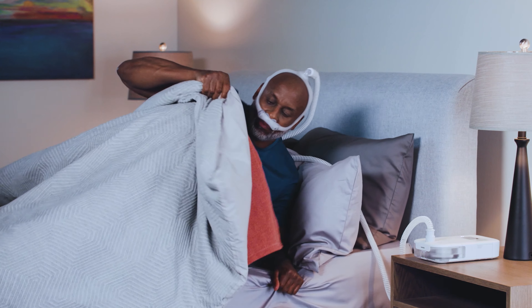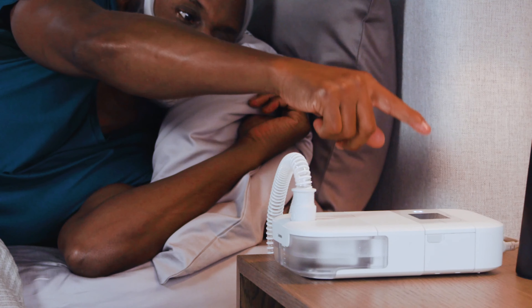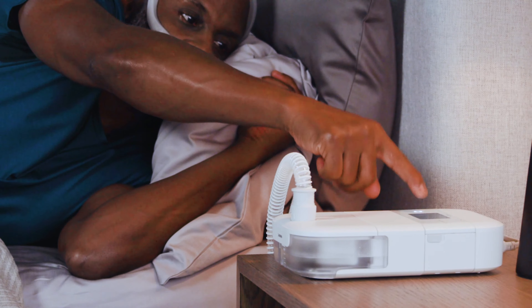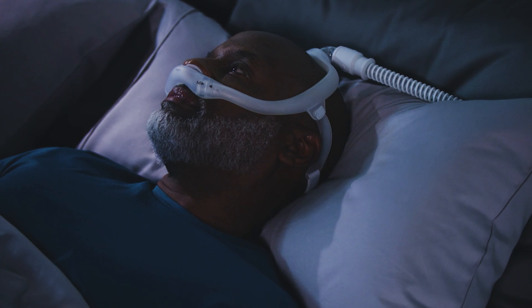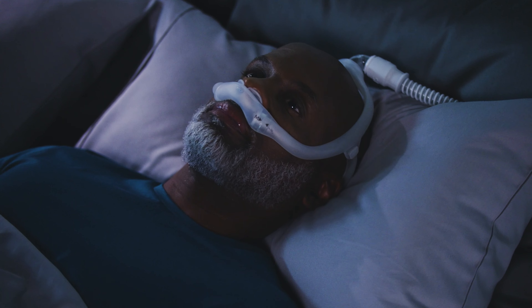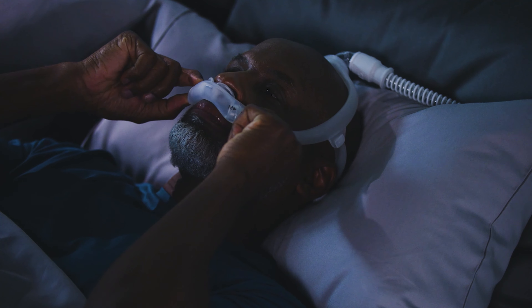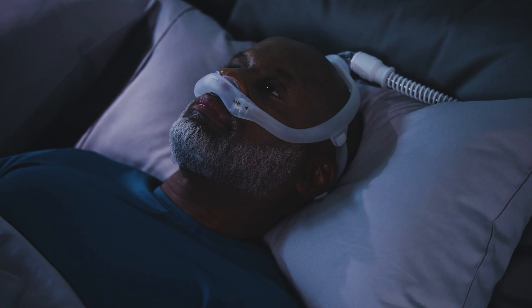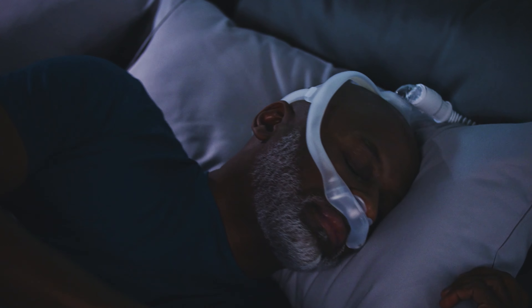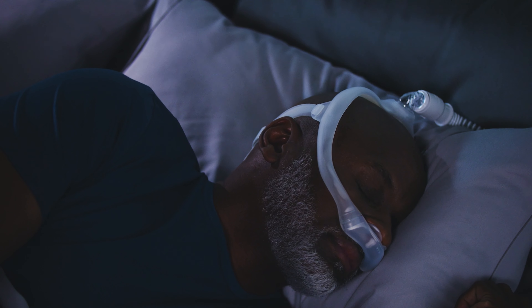Lie down and turn on your CPAP device. Breathe normally through your nose and turn your head from side to side. Some air leaking is normal, but if you feel an excessive leak that could disturb your sleep, pull the mask away from your face and gently set it back into place. Continue to try out different sleeping positions until you feel comfortable with your mask fit.